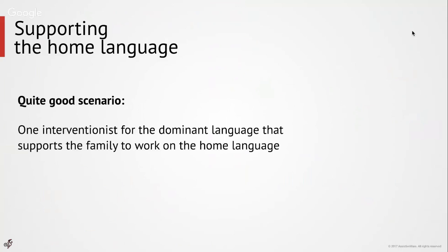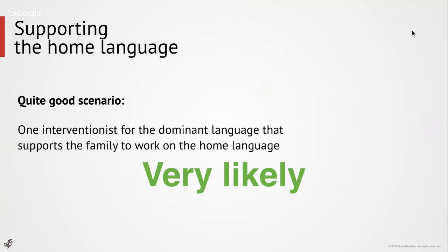And then you're going to ask around the school or hospital or wherever you work. And likely you are going to find some native speakers of Spanish in the staff, maybe a teacher or an aide, and they don't need to know anything about speech therapy, but they can help you with the customization in the vocabulary and help you defining words to target for different contexts and intents. And for the actual modeling and the actual intervention, you are going to try to rely on the family to carry that at home. So I believe this is going to be the most likely scenario in which you are going to be.